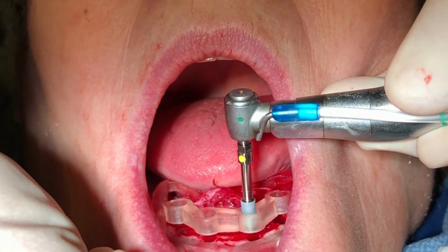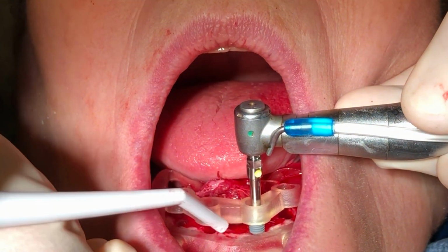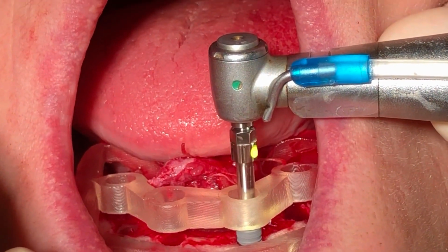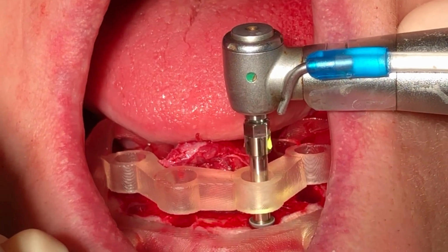Once this is connected, and normally there's a securing mechanism that once you attach that tool to the implant, it's not going to go anywhere. It's not going to fall out of that tool, and it's going to be very easy for you to take it to that osteotomy that you just recently prepared. And then all I have to do is just start drilling that implant into that socket.